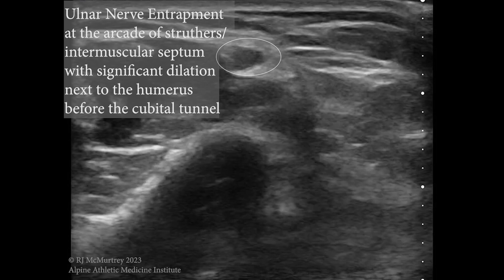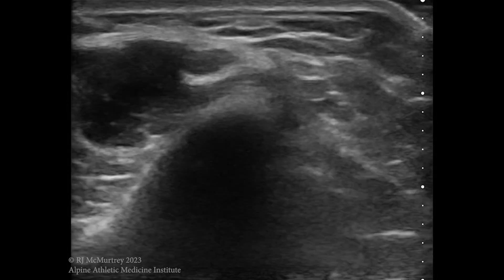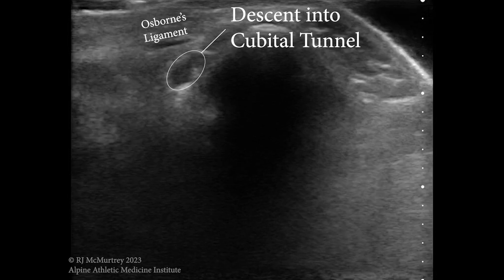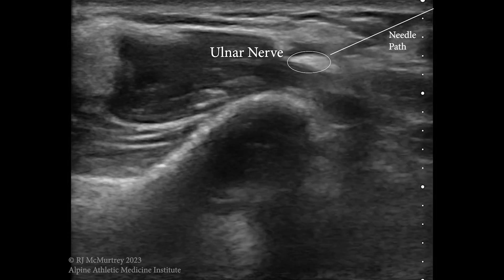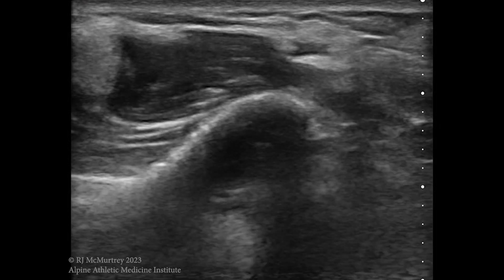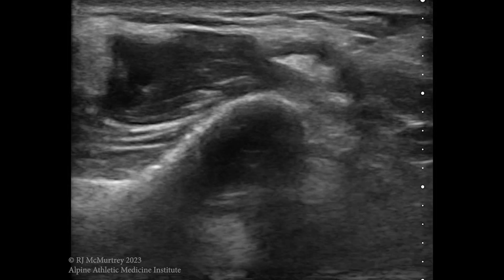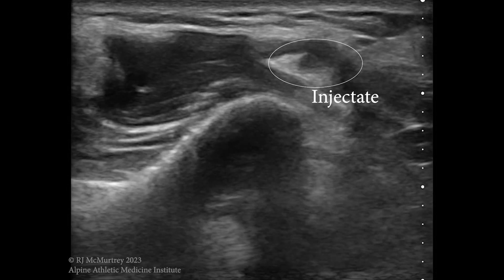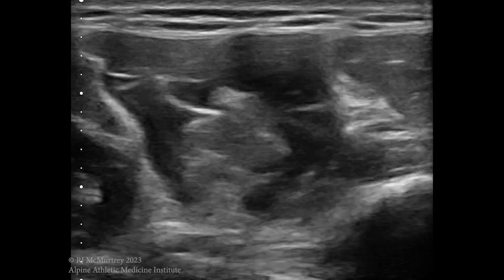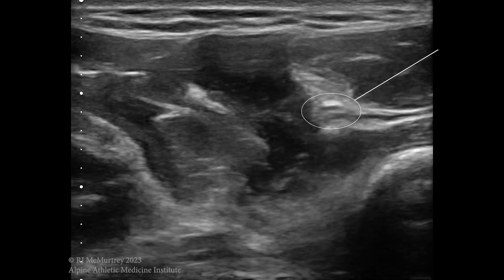I also had a patient a couple months ago with an ulnar nerve entrapment at the arcade of Struthers — actually it was slightly higher, at the medial intermuscular septum. The fibrosis around the nerve was really obvious and the nerve was significantly dilated. You can see the nerve dilated next to the humerus bone, and then the nerve diving down into the cubital tunnel. The injection is actually easier to do in the arm than down at the cubital tunnel — it was a matter of dissecting into the thickened fascia surrounding the nerve and getting good spread into the nerve sheath and fibrous bands to loosen up those tissues.